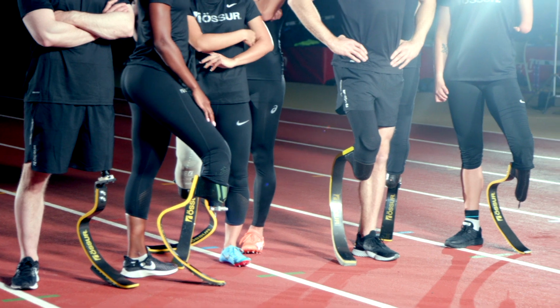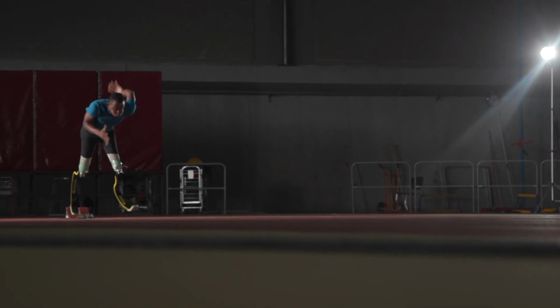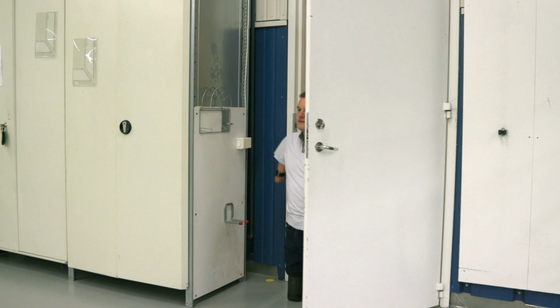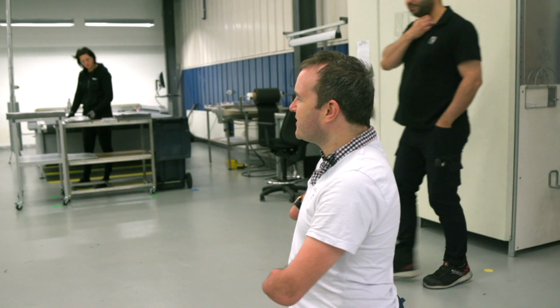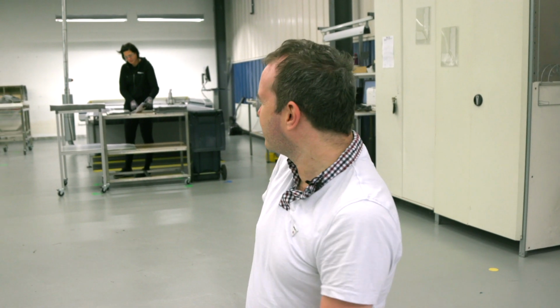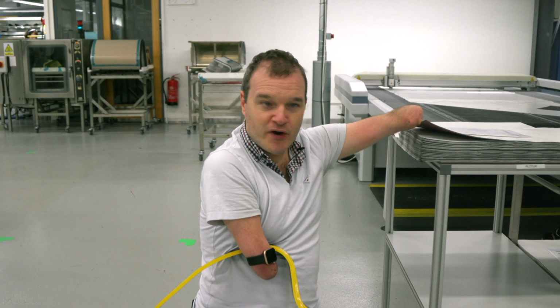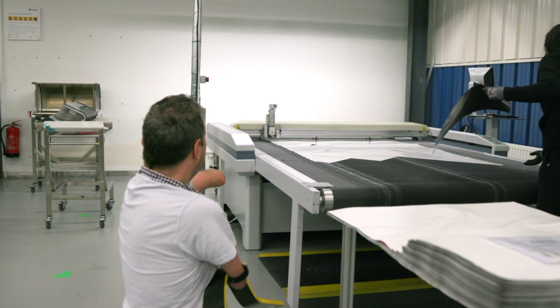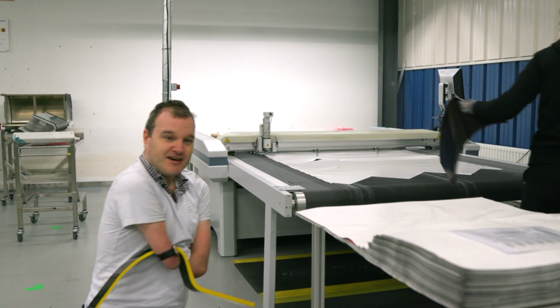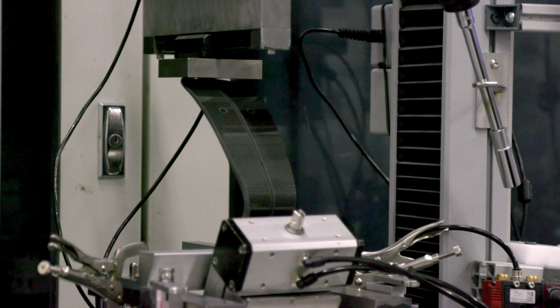But I couldn't come all the way to Iceland without actually seeing how they're made. And the design and manufacturing process is more involved than you might think. Wow. I'm used to hospital workshops, which are usually one man on an Allen key. This is insane. This is sheets of carbon fibre fabric. You can see it on this machine here being cut into strips. It's actually mind-blowing to believe that these really thin little pieces of fabric just here will eventually turn into one of these. What's amazing is you can actually see the process following it all the way through.